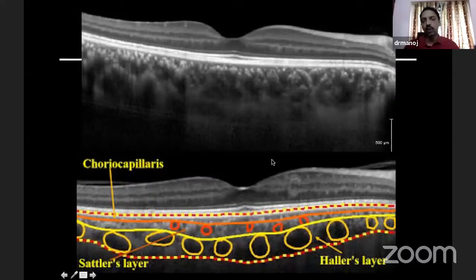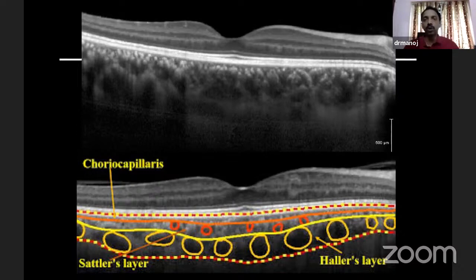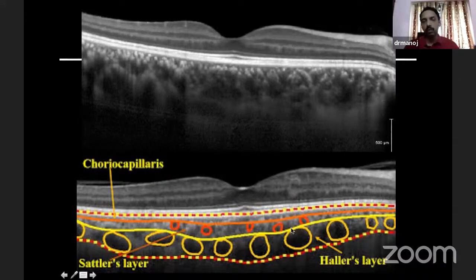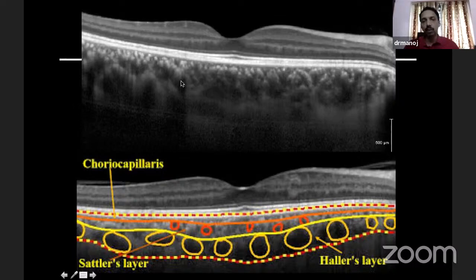OCT is also helpful to study the choroid. This is what I mentioned as enhanced depth imaging — with a normal OCT, sometimes the choroid is not very clear, so you need to use this enhanced depth imaging mode, available in most machines, to study the choroid in detail. However, the swept-source OCT is the best to study the choroid. Here you can see the larger vessels — these are the Haller's vessels, the smaller vessels are the Sattler's layer, and the small dots represent the choriocapillaris.